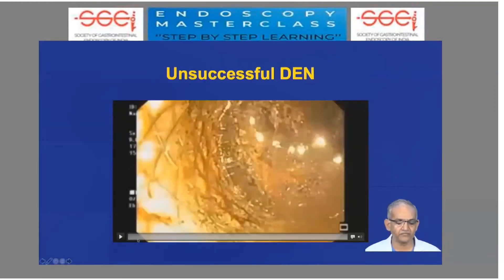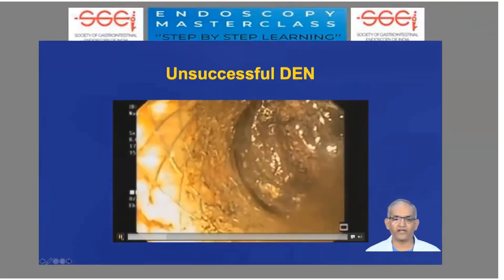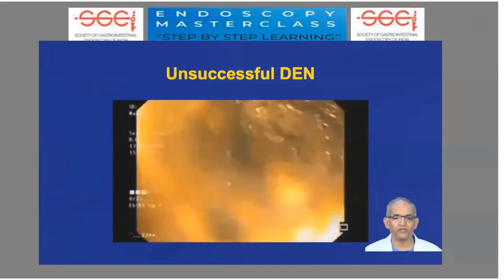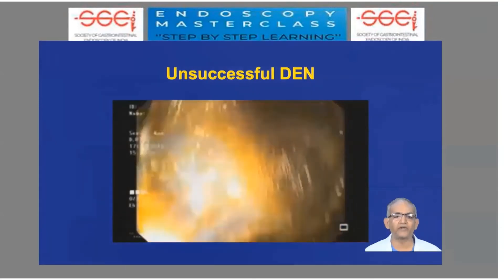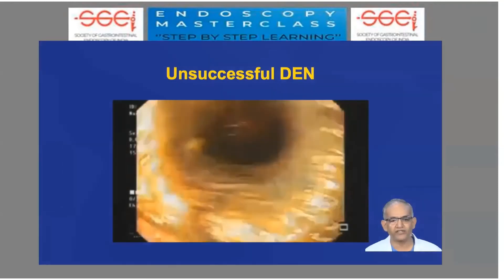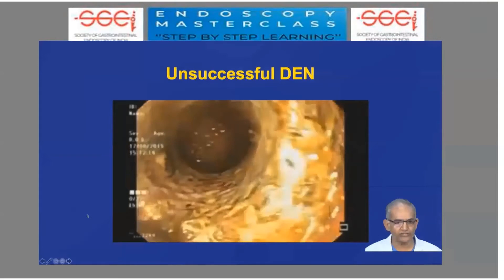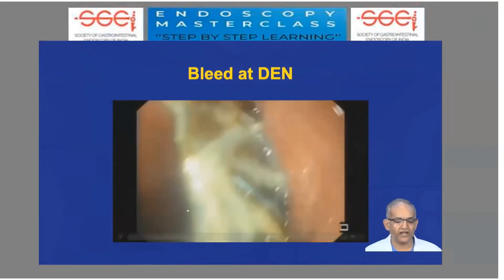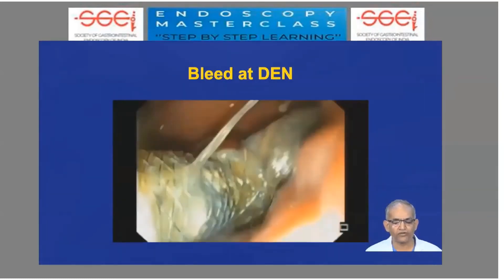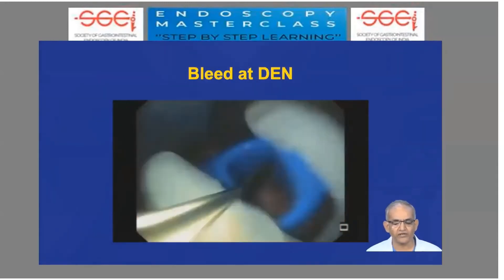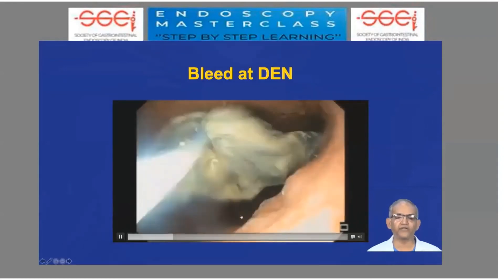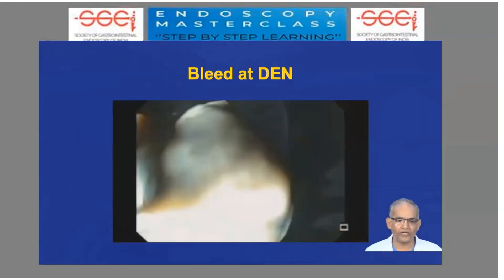For external migration: this can occur when a debris chunk is so large and adherent that when you attempt necrosectomy, it is only piecemeal — nibbling on a very large piece with nothing coming out easily. These are time-consuming and not very rewarding. As seen here, the stent has migrated externally into the lumen. In this case, necrosectomy could not be done as debris was occluding the stent. Once the stent was removed, we went inside and found a large chunk of debris peeping out of the fistula, which could be grabbed and pulled out entirely.